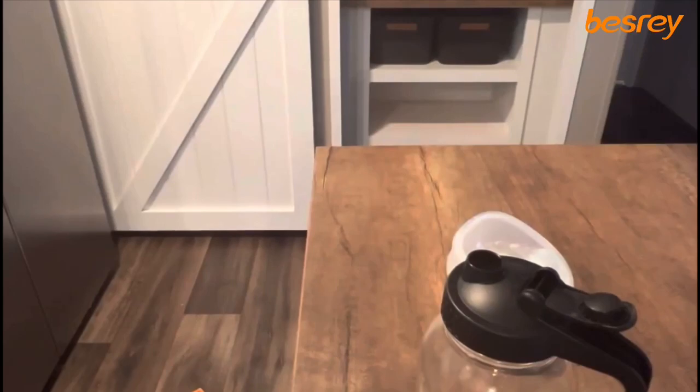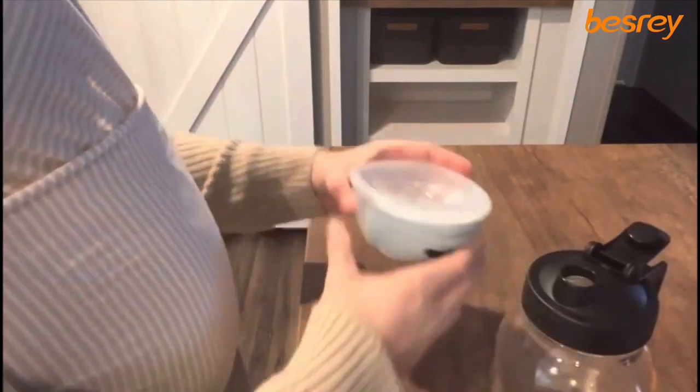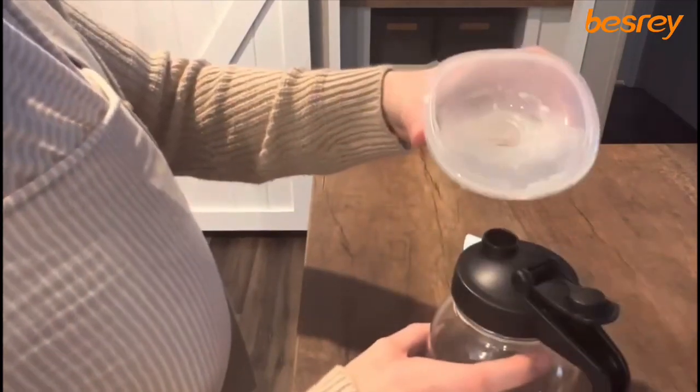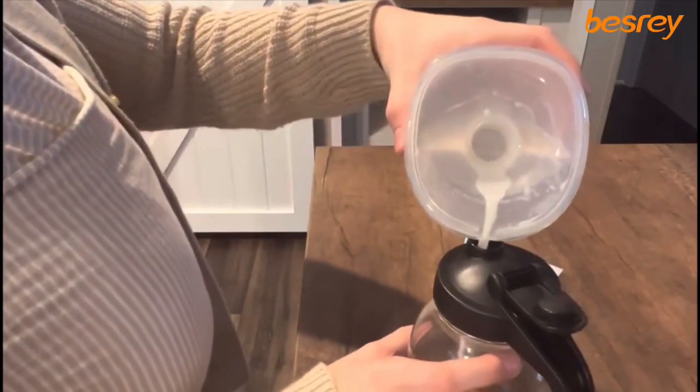I'll show you guys how I pour the milk into a cup or bottle. I use the pitcher method right now and it's my favorite. Here I am pouring into the pitcher — it's super easy and I haven't had any spills with this one.